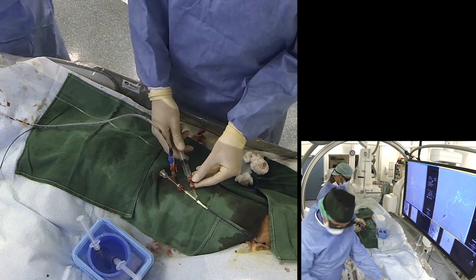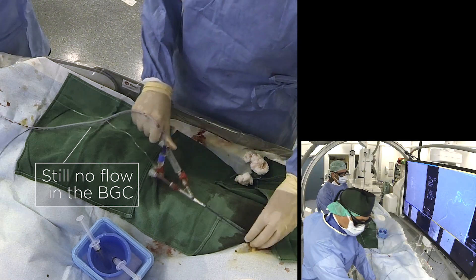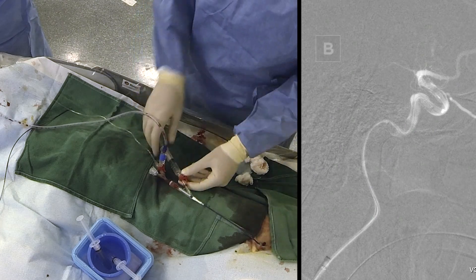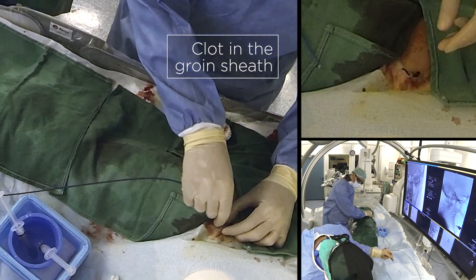We deflate the flow arrest balloon, but in most cases when you have this situation you still don't have flow because of carotid spasm. What you can do is position the tip of the balloon guide catheter a little bit more proximally and see if you have flow. There was still no flow in the system, so we concluded it was occluded by clot and removed the entire balloon guide catheter under permanent aspiration. You can then see the clot burden in the sheath — it was a really long clot, and we even lost some fragments in the femoral sheath, which we then had to remove.